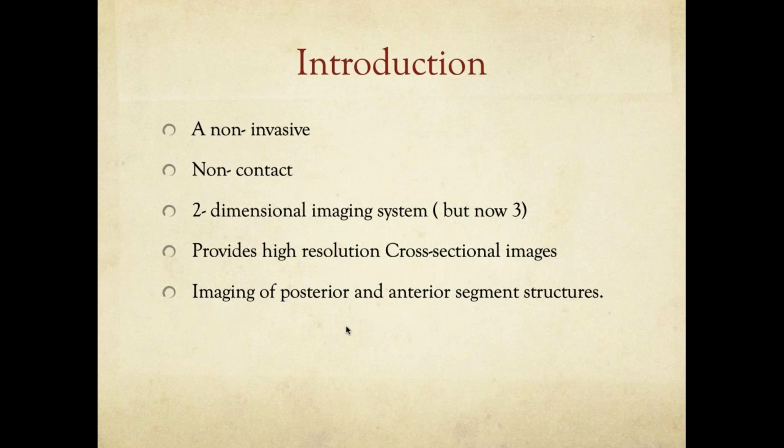different. It is the smallest distance that you can perceive, or that the machine can detect, for you to tell that these two structures are structurally or integrally different. Like, I mean, when you are trying to say that, that's the resolution, right?